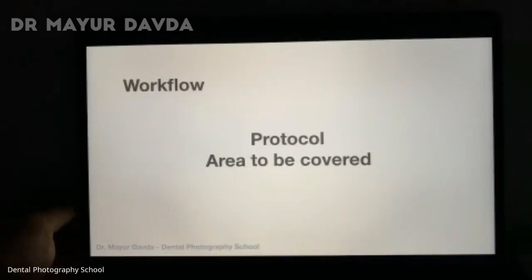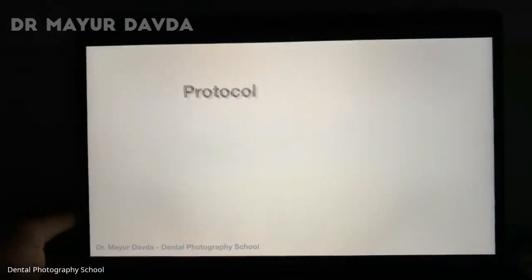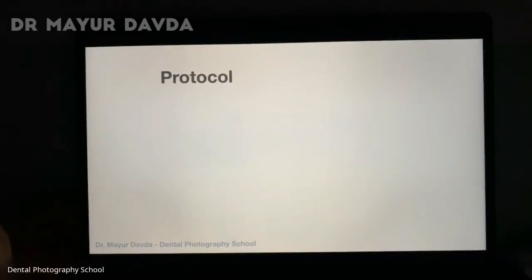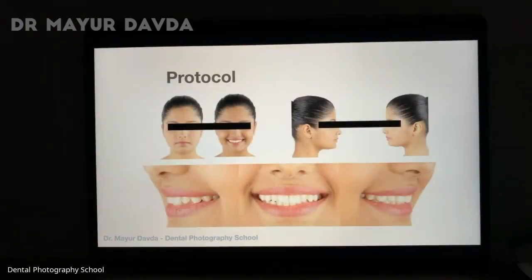All right. So if you are into protocols, in the sense if you are into early orthodontic treatments or interceptive treatments, you have to follow a protocol that you have to give it to your orthodontist in future. Or if you want to publish it, you have to have a protocol in place. So what is the protocol that we are talking about? Protocol basically means a fixed number of images that you have to shoot if you want to publish your images or publish your case.